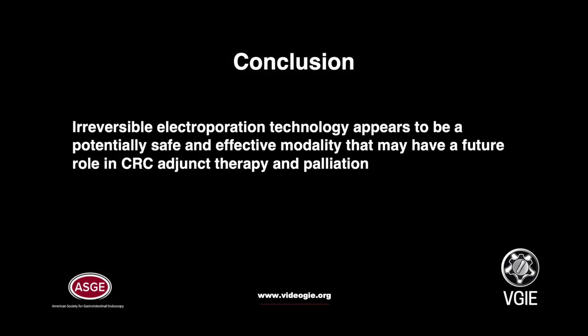In summary, irreversible electroporation technology appears to be a potentially safe and effective modality that may have a future role in CRC adjunct therapy and palliation.